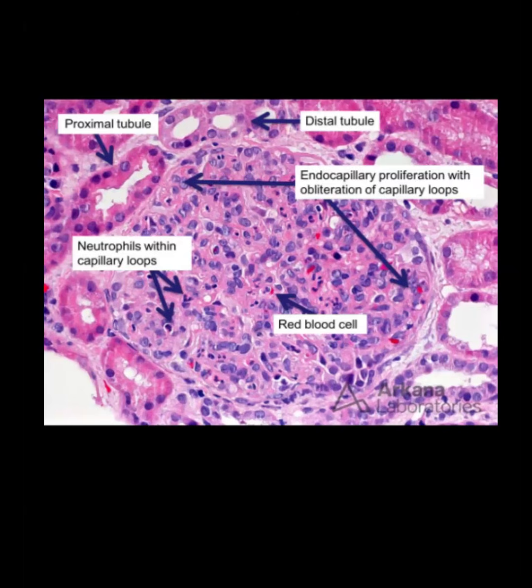In a transplant patient, when they give you the tubules, usually they are showing cell mediated rejection, and sometimes they show you the tubules and one capillary. So there is peritubular capillaritis, and peritubular capillaritis is antibody mediated rejection. So here you can see the normal anatomy. Whenever there is a diffuse proliferative glomerulonephritis, what are the differentials?